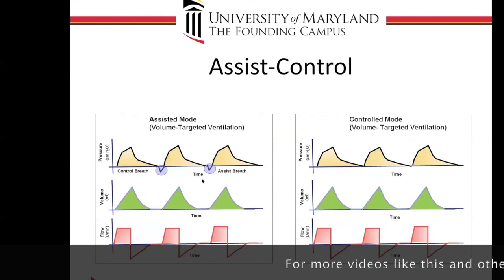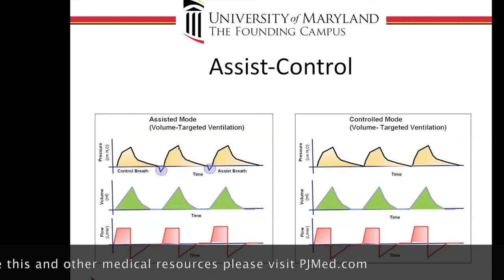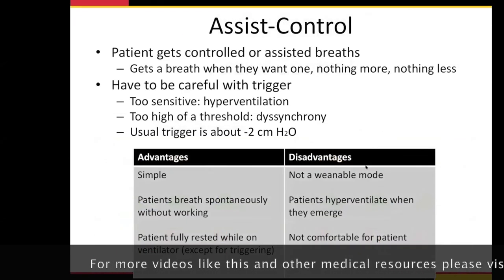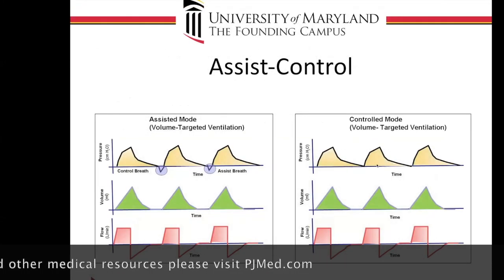And so if you set this up perfectly, you could time this. So when the patient says, okay, I want a breath, bam, ventilator kicks in. It gives a very blunt, square waveform. See that? It's a very primitive waveform. It's square. Nothing cosmic about this. And when they're paralyzed or heavily sedated, they're not going to be taking any breaths. They're just going to be getting a breath every whatever you program the ventilator to do. Do you see that? There's no triggering here.